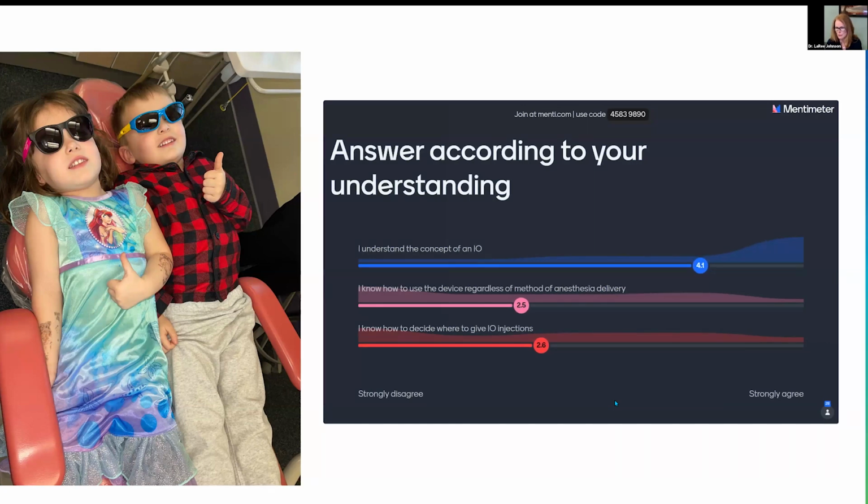Seems like most people I'm encountering just use it for intraosseous, and if they don't have success, they pick up a conventional syringe, which I don't recommend. It's still more compassionate to use these devices because of the specialized needle and the digital delivery of the solution. It makes it much less painful. All right, so seems like we can just skip on to, okay, I got you guys.